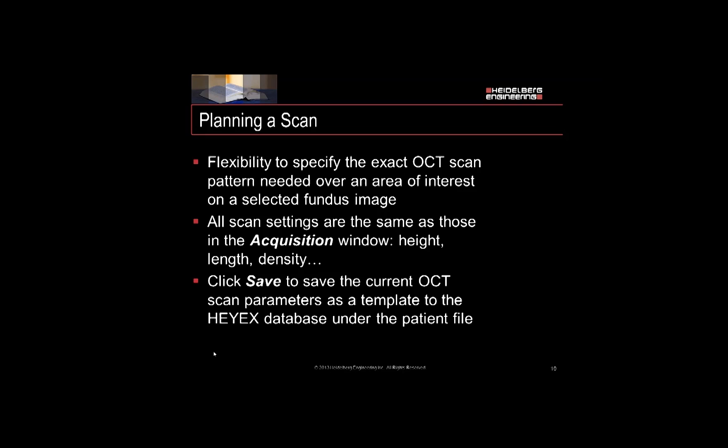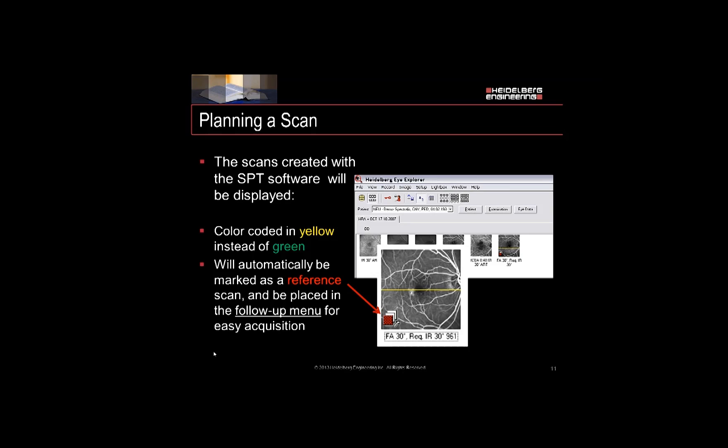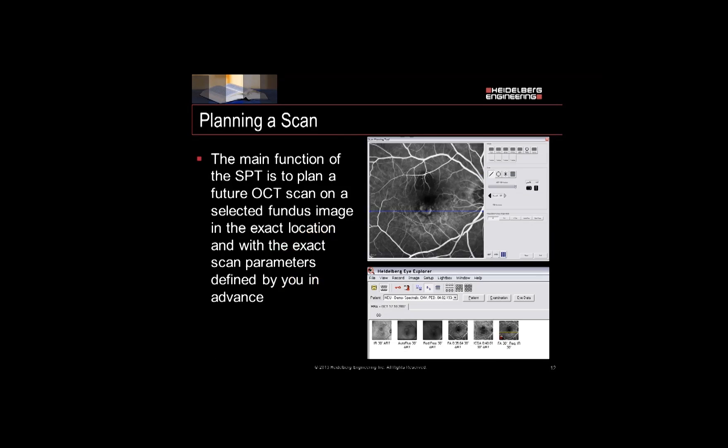The Scan Planning Tool is flexible. It allows you to mix and match scan settings that may be different from the original fundus image. For instance, you can select a fluorescein angiogram image, build a scan over it, and select that on the next examination it should be shot as an infrared image. Click to save and all the parameters will be saved as a template to the patient's file. The scans created with the software will be displayed with a color-coded yellow scan pattern instead of green and will automatically be marked with a reference scan and placed in the follow-up menu for a future acquisition.